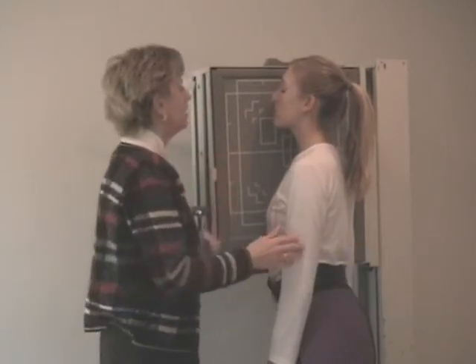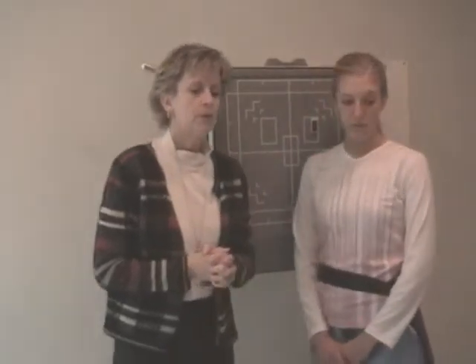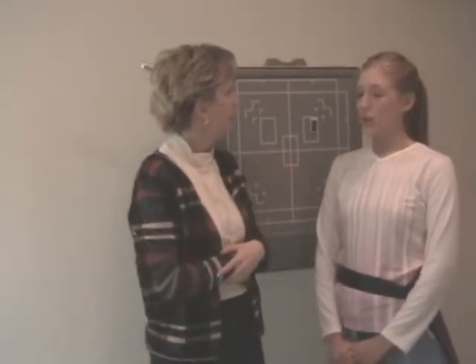Okay, Kristen can relax for a second. A lot of techs choose not to do a patient in an anatomical position. Remember, I just demonstrated the anatomical position. That means the face and the head stay together, patient's looking out straight. Some techs choose to actually turn the face a little bit. Why don't we discuss the pros and cons? What do you think?